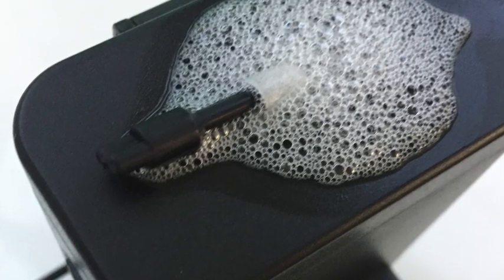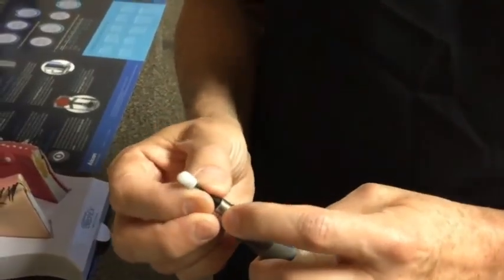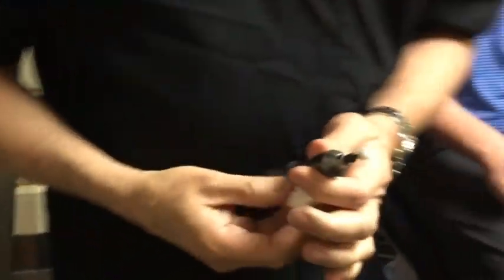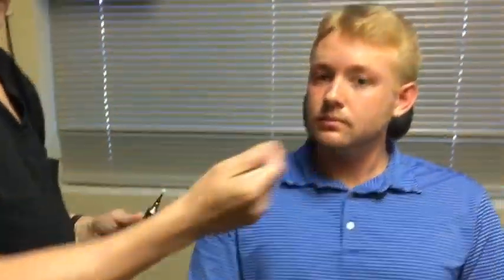Okay, go back to your charging base, get your second tip. And we're going to do the opposite eye. Now I'm right-handed. Right-handers always stand on the patient's right. Left-handers stand on the patient's left. I don't want to come over here as a right-handed treater and try to treat the left eye.